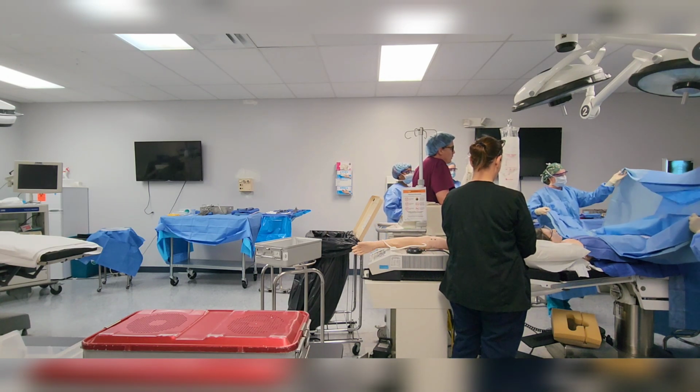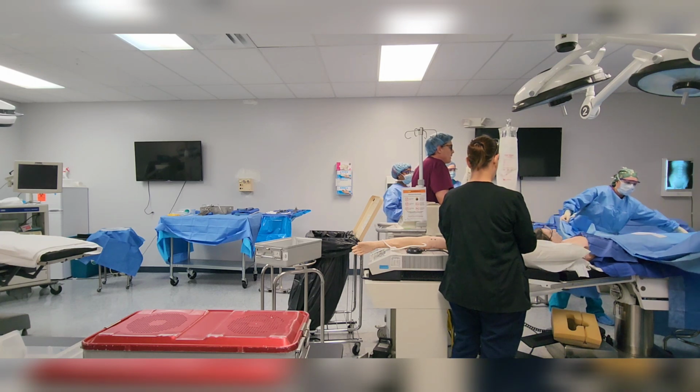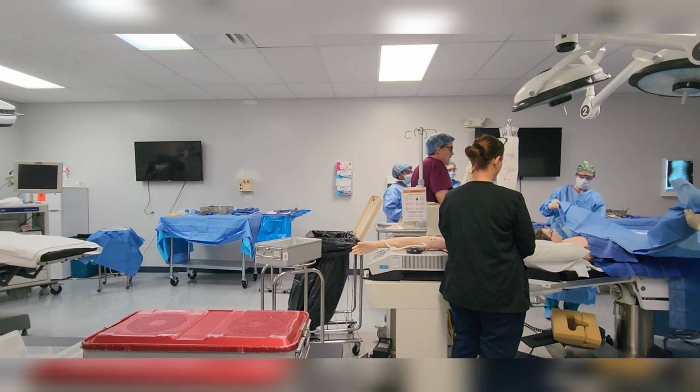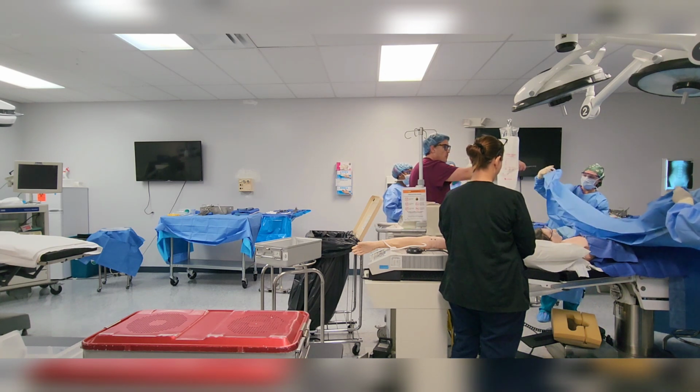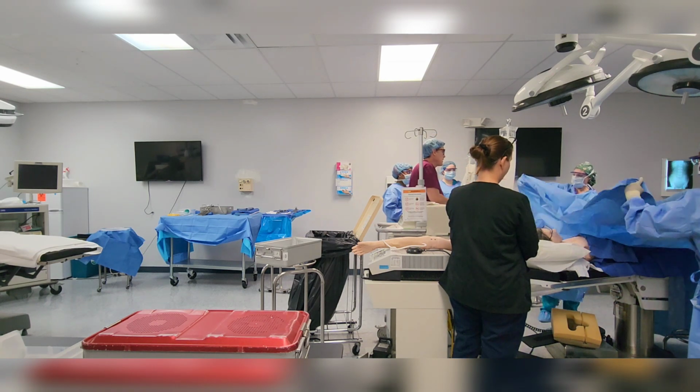So good. While you're cupping your hands, because you never know there's a Neptune down there and you might hit it, always protect yourself. Then come to the field here and protect your hand that way. There's a little part that you can come out, because they may have your legs or your arms extended. Good.